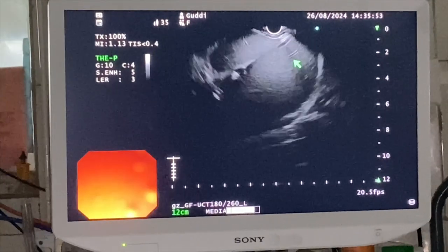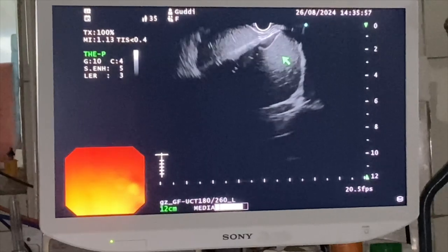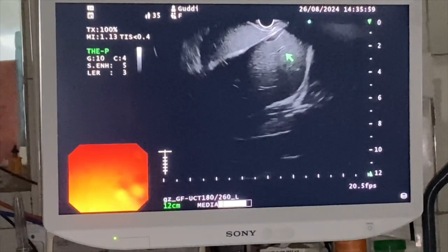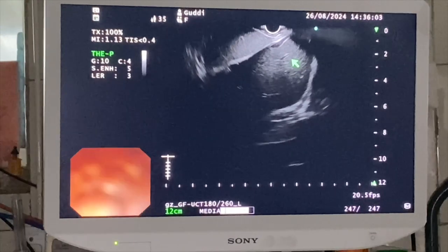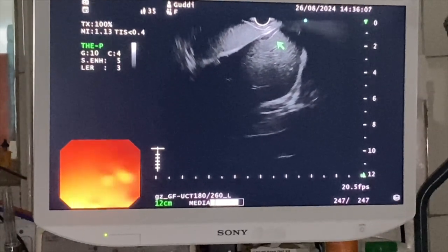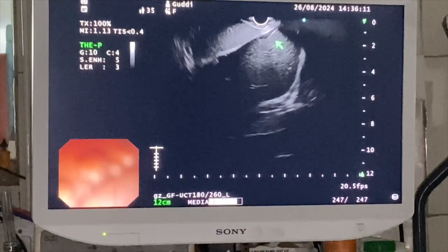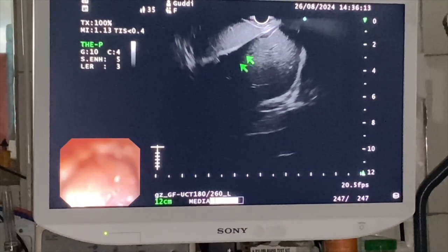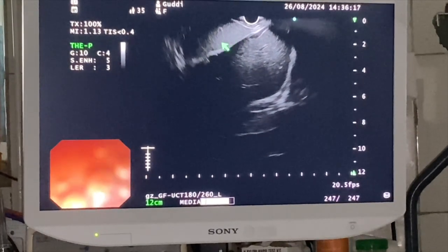So this is a beautiful demonstration of the ligamentum venosum. One more thing, this ligamentum venosum unites the IVC. It is actually a ductal remnant of the ductus venosus. It unites the IVC and the umbilical portion of the left portal vein.